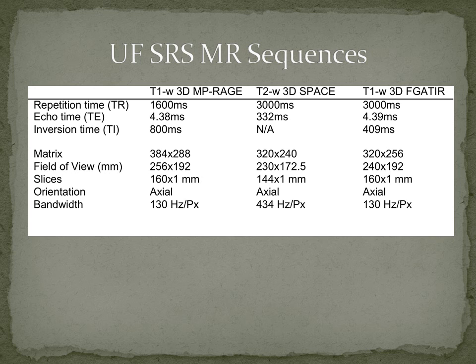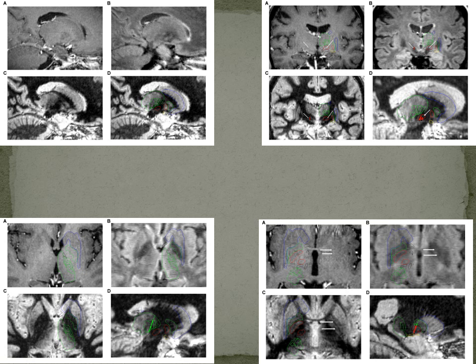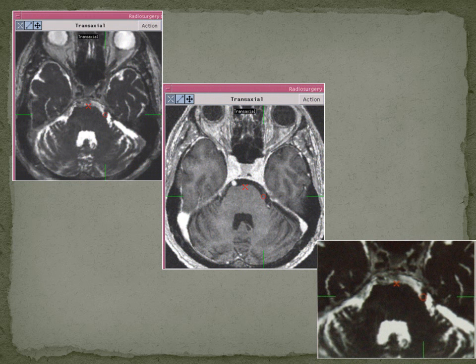The MR sequences that we use are relatively standard. We've tweaked them up over the years. There's a new MR scanner going in across the street now, and later on this week we will use our standard to go over there and scan and retweak these sequences. Unfortunately, I am the standard. So these are just some of the sequences that we've used over the years, and we use these for all different types of image guidance, not only radiosurgery, in the day-to-day practice with the department.